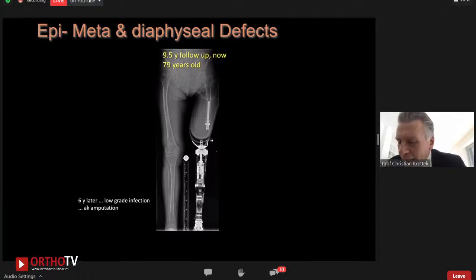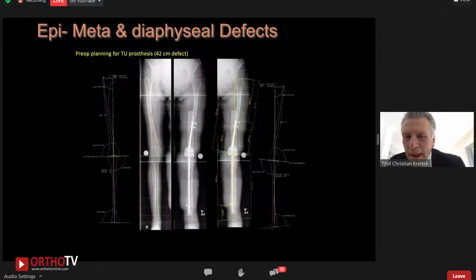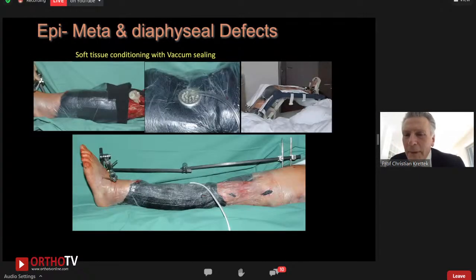We opened the external fixator for the exercises. Look here on the right side, she still has the X-fix pins. But for a couple of hours every day, we had her open to exercise. And when she was walking, we fixed it.